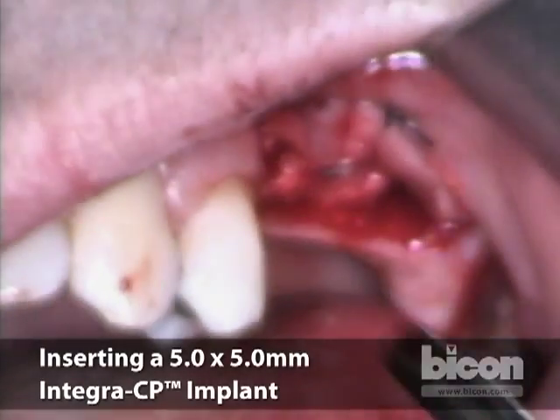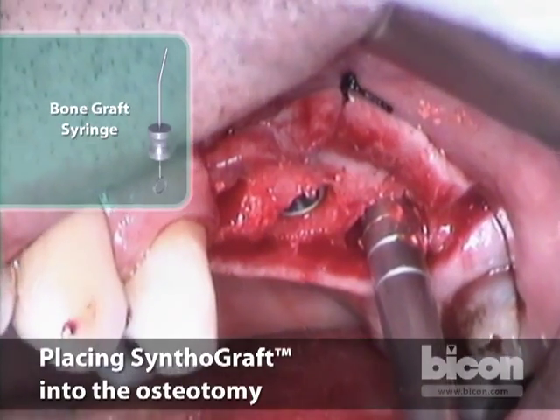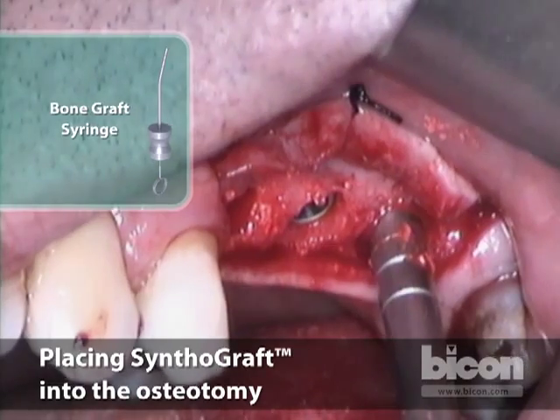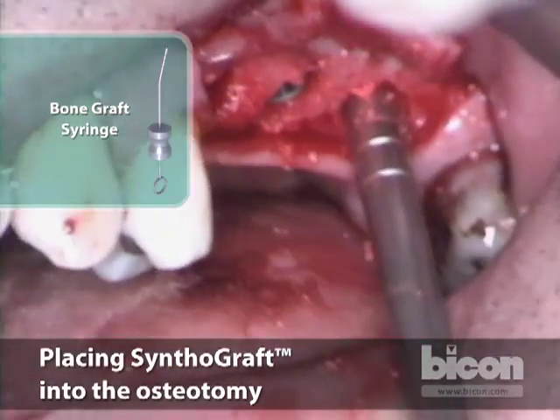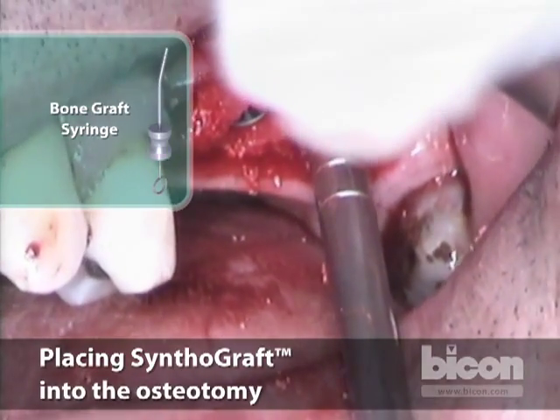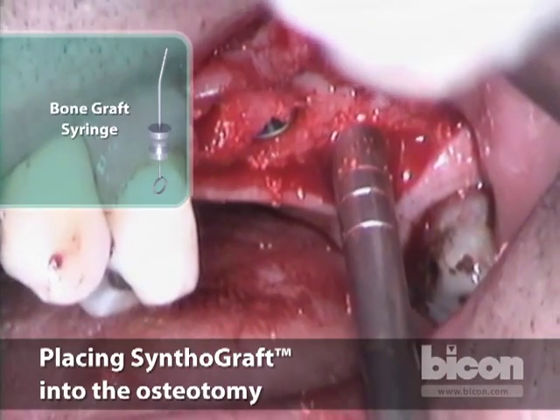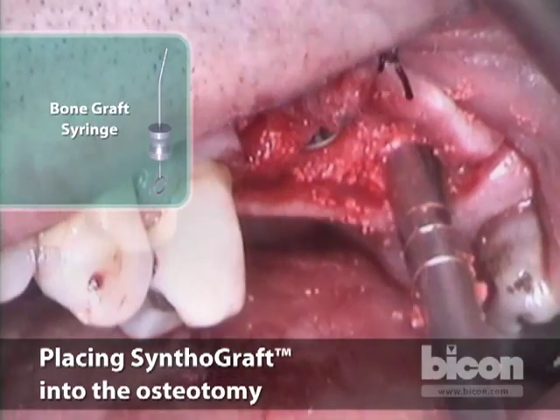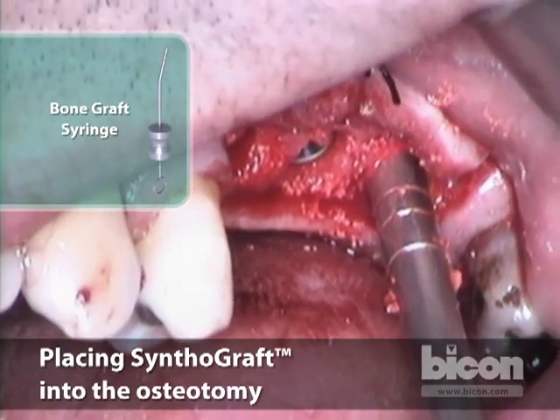It also makes aesthetics a lot easier to achieve. Again, the same thing — you're going to gingerly, very gently, and slowly inject the bone graft. This is a bigger osteotomy and will require a lot more graft. There's kind of a little bit of a pumping action — I inject a little bit of bone, then pack it a little bit, and so on.